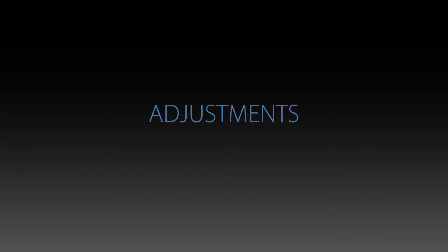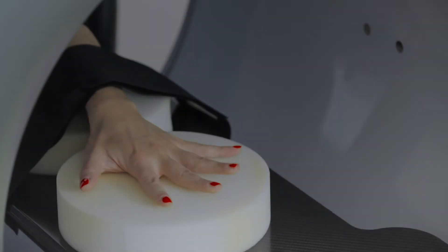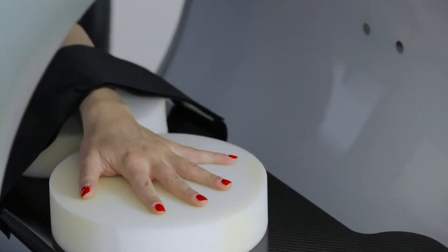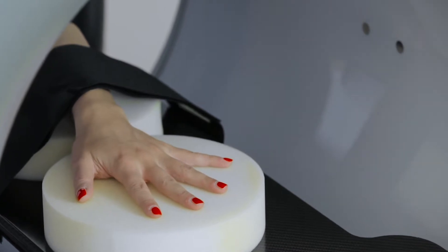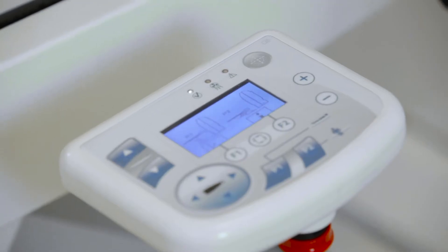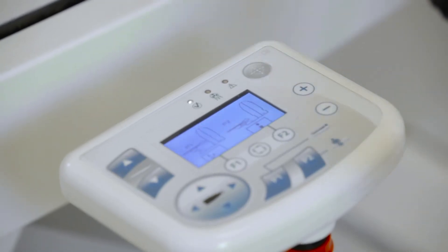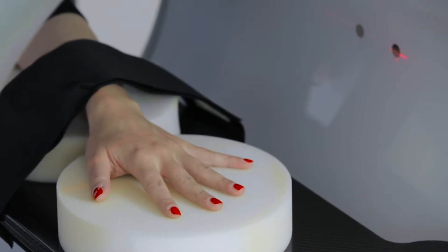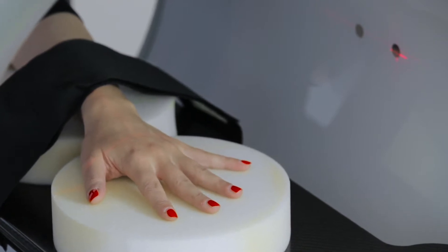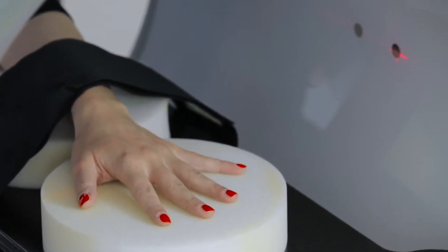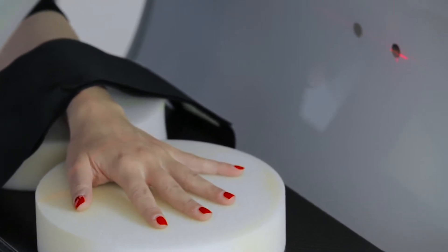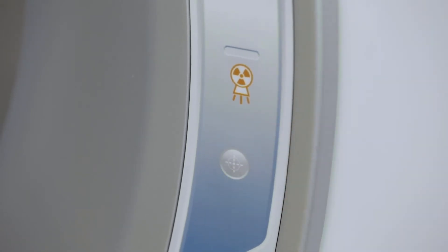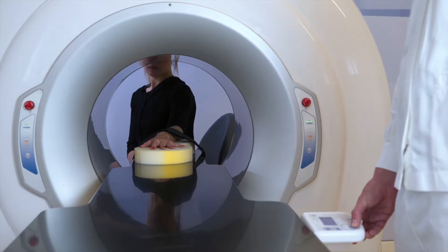For precision adjustments, the laser centering device can be used. To activate it, press the laser key on the control console. It is necessary to have started the NNT software, or use the keypads on the sides of the scanning unit.